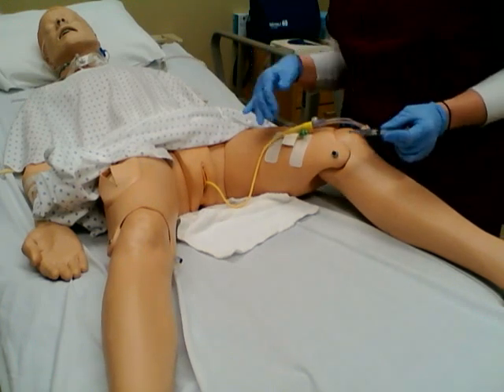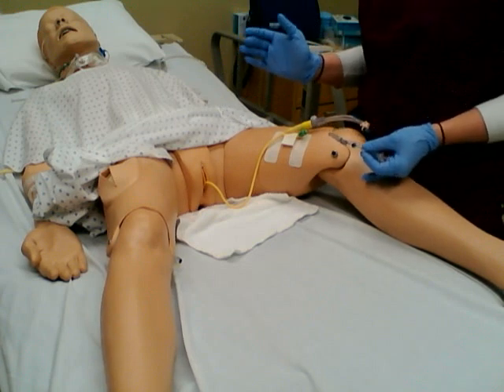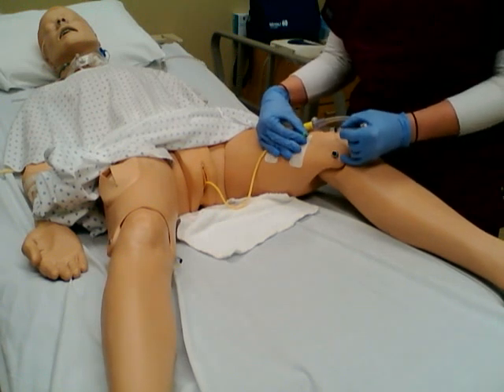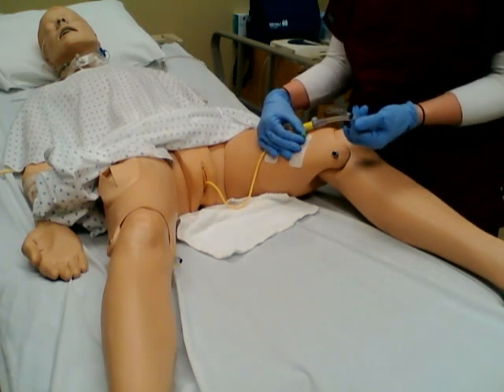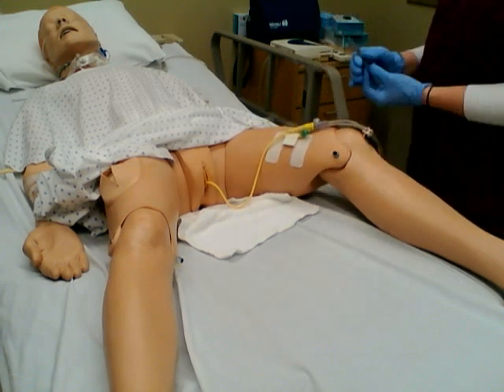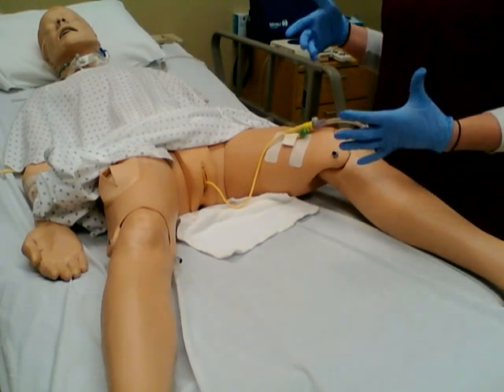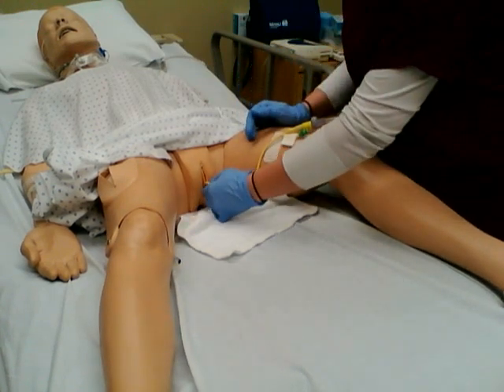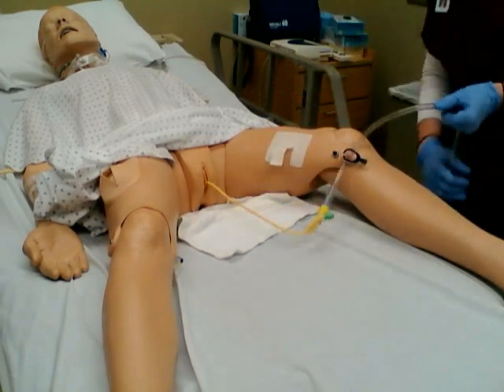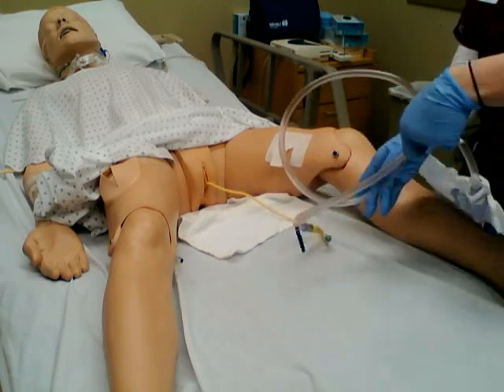Another good thing to keep note of when you're inserting the catheter is that if it's very painful for the patient, it's not in the right location. It's in the urethra. So now that I'm removing, I'm going to stick your syringe into the port here, remove all the water that was in the balloon, and dispose of it into the sharps container, making sure you have all the water again. And then you want to remove it from the leg, making sure that everything is free and you're not going to have anything that tugs. After my bag is empty here.